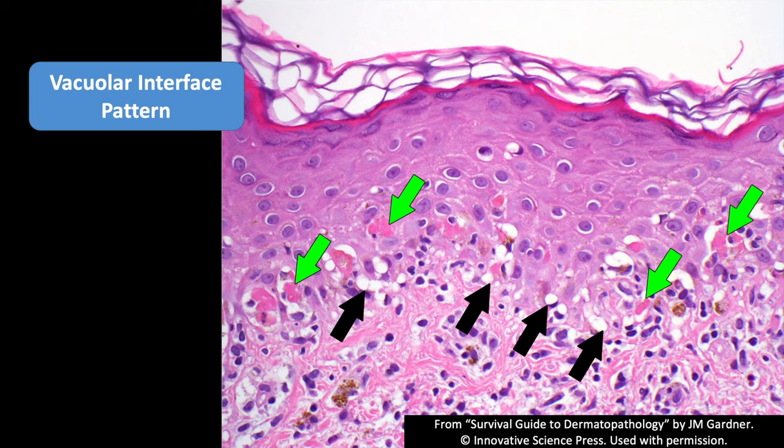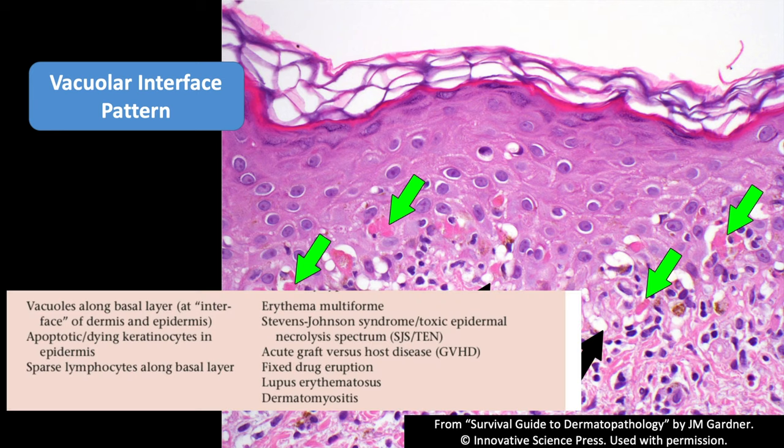This is a very robust example. Sometimes it's much more sparse and subtle, and you may only have some focal dying keratinocytes and little bubbles. Just keep that in mind — you can go to higher power and look if you're thinking there might be interface change. Finding this is really helpful because there are diseases that tend to have interface change and others that really don't, so it can help narrow down the differential diagnosis.